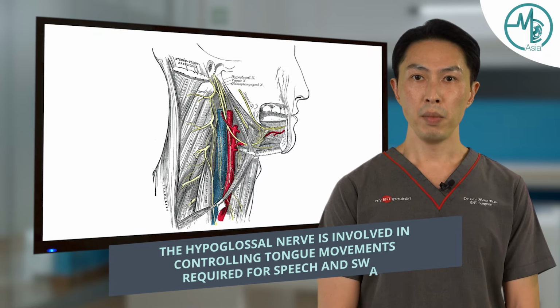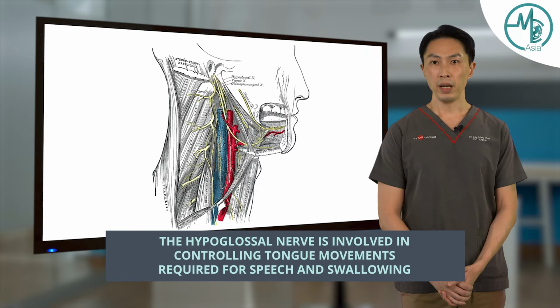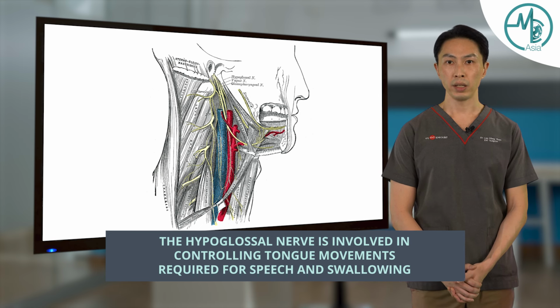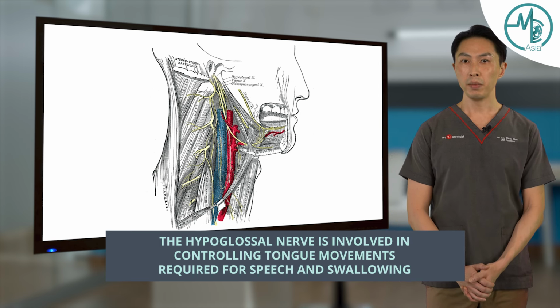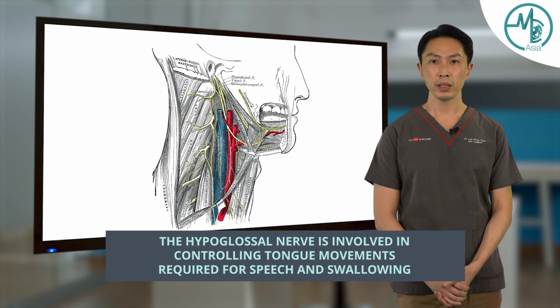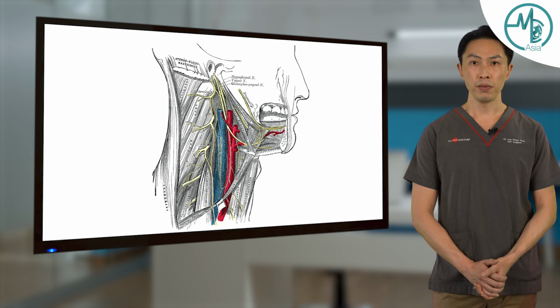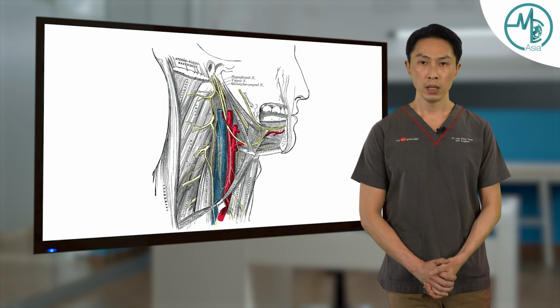So while not all obstructive sleep apnea patients may benefit from hypoglossal nerve stimulation therapy, a good number of them may benefit from them. Patients that will benefit from this therapy will be those with what we call moderate or severe obstructive sleep apnea. In medical terms, that is an apnea-hypopnea index, or in layman terms, that is a choking index count of more than 15 counts per hour.